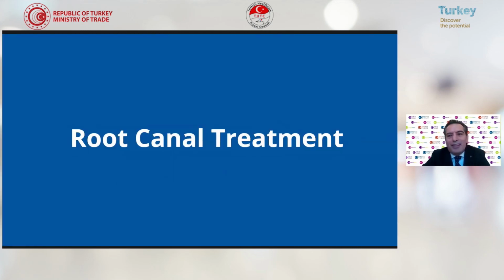Root canal treatment. This is one of the treatments that patients are always afraid of, and they think that it is a very, very difficult procedure and very painful procedure. As I mentioned at the beginning, the first step is to make a good anesthesia, and then you can make everything on teeth, even root canal treatment. And you start your root canal treatment with anesthesia. And since we are using very good machines, not with our hands, we are making these treatments with machines, very, very special machines.